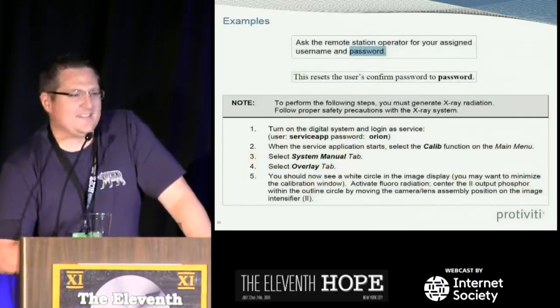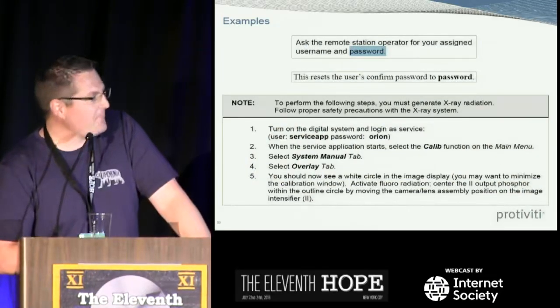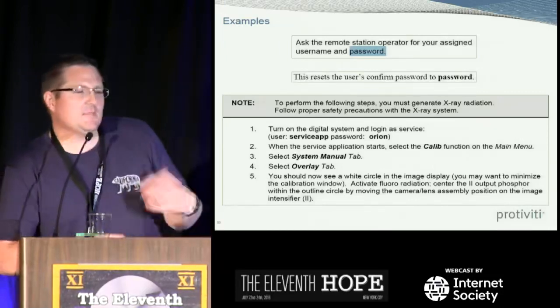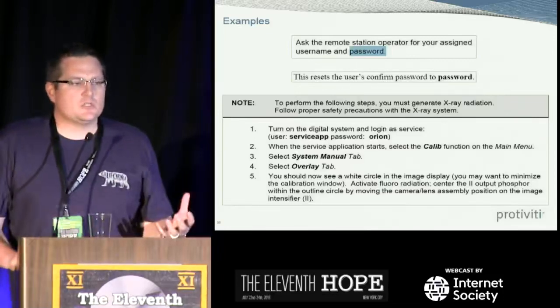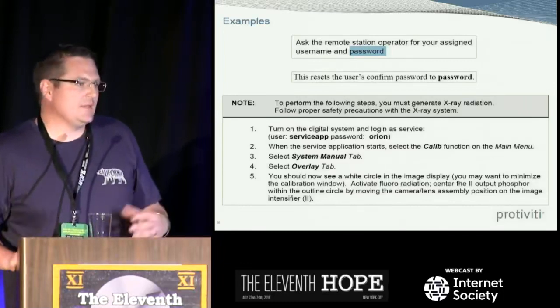Or ask the remote station operator to reset it to the super secure password of password. The bottom one here, this is a good example. This is kind of to get in the mindset of a hacker, or how we look at intentional use versus how you could modify a system and bypass the intended use.